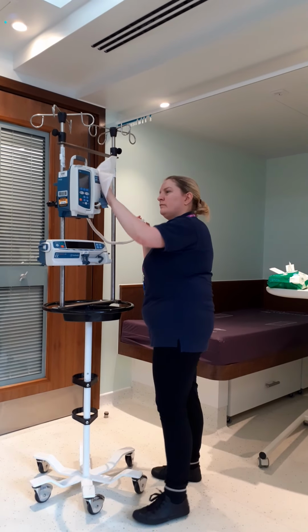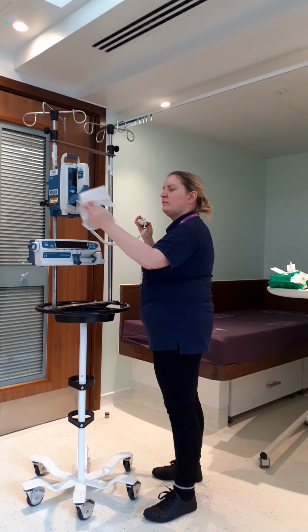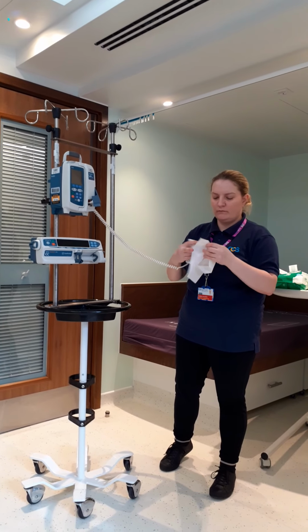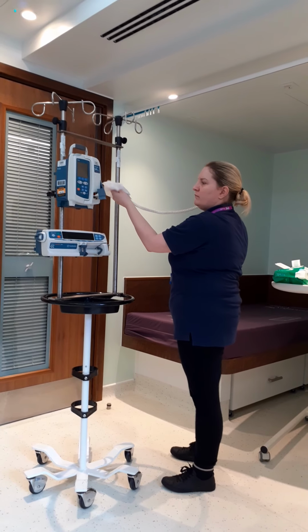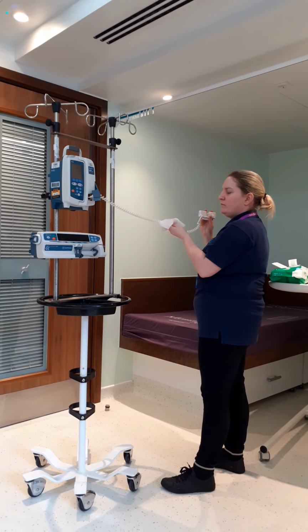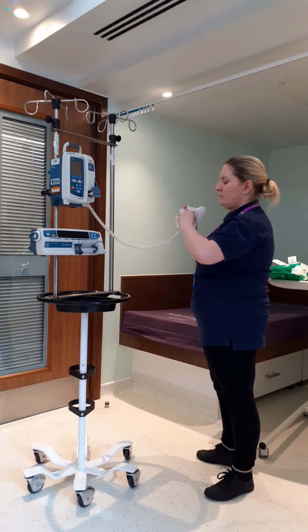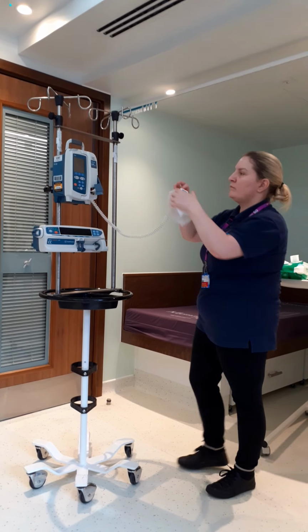Because this piece of equipment is then going to be split into different sections, we're making sure we clean as much of it as we can, but specifically the part that's going to go onto another clean surface, so that we're not moving contamination from one area to another. If you're cleaning things like leads, you really do need to clean all the way along, making sure that you're pulling out some of the spiral lead to make sure that everything gets equal coverage.